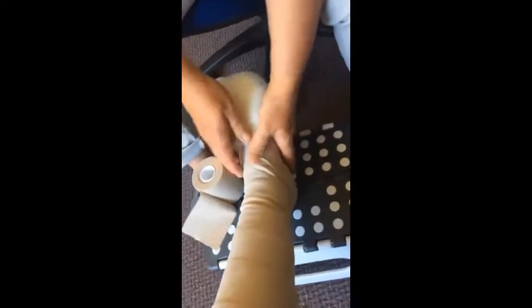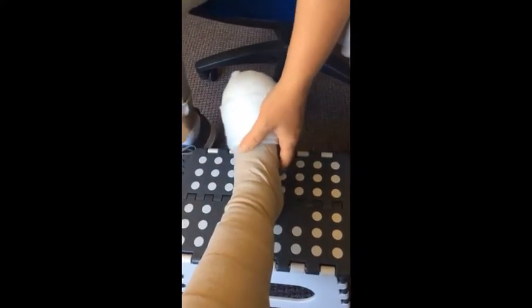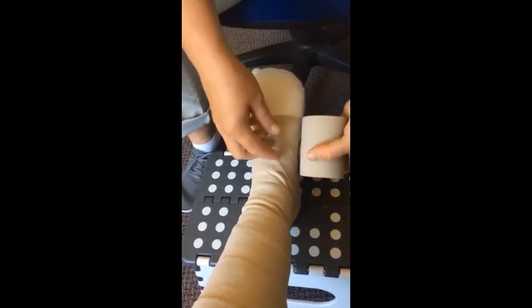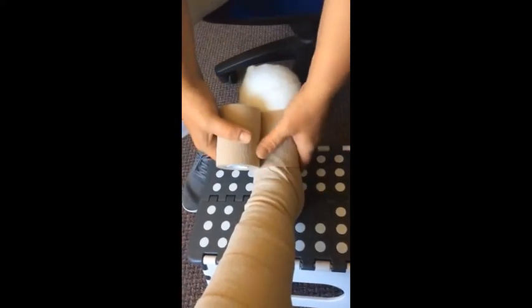I need to make sure I haven't gone too far up the foot so that I've got plenty of margin to go around. Taking your 8cm Actico roll, rolled up as you always would, we're going to do a turn around the base of the foot to anchor it. I've already put whatever compression I need in the foot with the bandage below, so this is not about compressing the foot — I don't need to put tension into the bandage as I'm going round. That's already been applied, so I'm literally just putting a little bit of stretch so that it sticks and conforms onto the foot and secures it there.